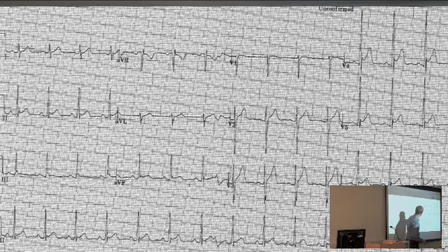And the reason you can tell that is the shape of the ST elevation. Look, it's particularly here. It's like a saddle, concave up, yeah? Now you often get that with, for example, a high take-off, or, characteristically, pericarditis. Yeah, this is a classical ECG from someone with pericarditis. Sometimes the PR segment is depressed, maybe a little bit depressed here. But classically, you get widespread saddle-shaped ST elevation in pericarditis.